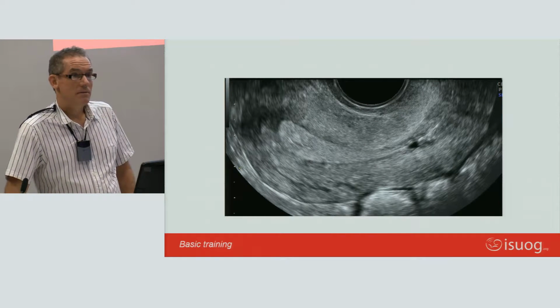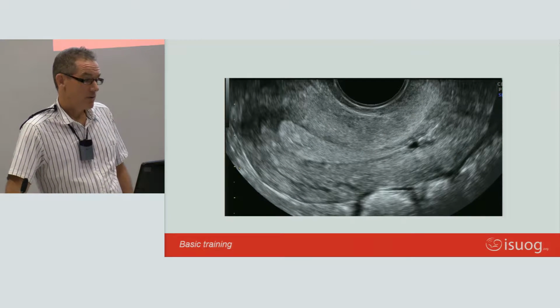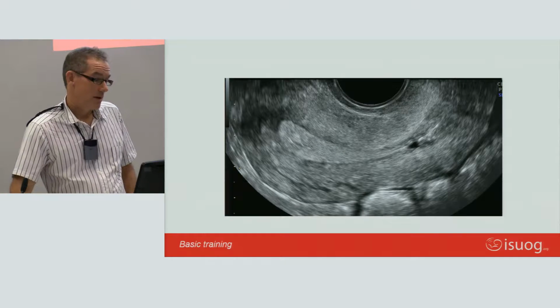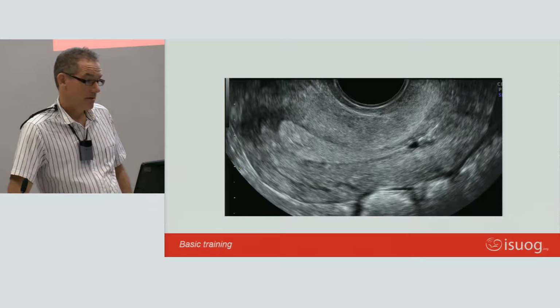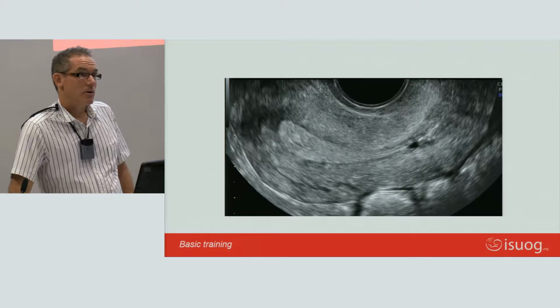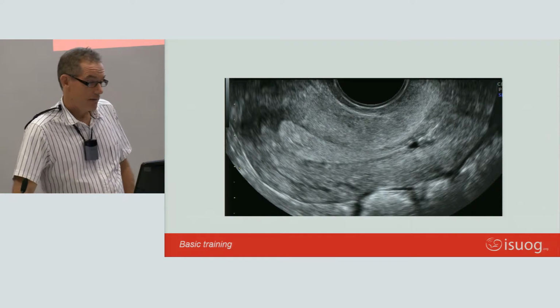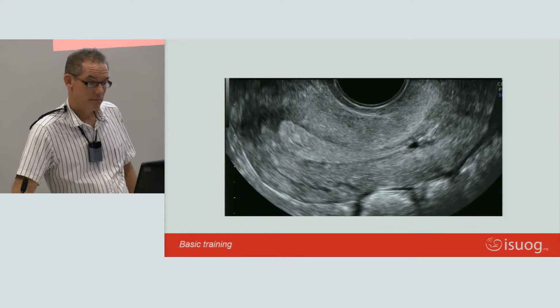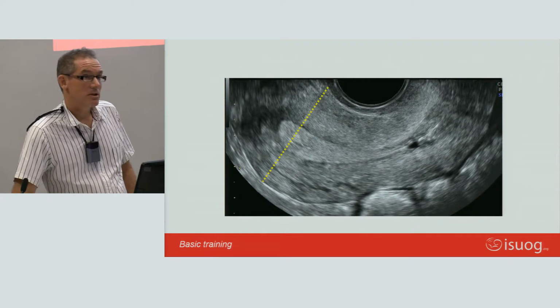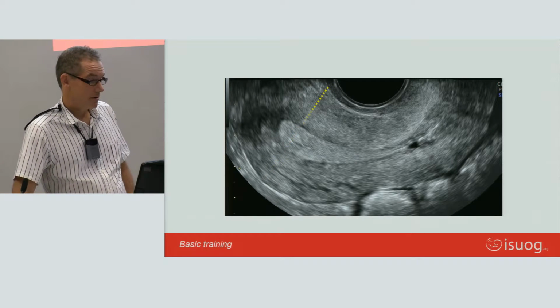This is the important plane that you need if you're going to take an endometrial measurement, because you want the endometrium to be parallel to your scan. In addition, this is the correct way to measure the ET if you're worried about postmenopausal bleeding. You can't replicate it in the transverse view, because you might be scanning obliquely and then you'll have an increased measurement for the ET. And certainly, if you're also going to measure anterior and posterior myometrium, then this is how you do it.